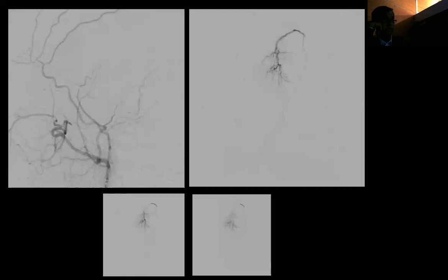All right. And this is the microcatheter. You can see probably the microcatheter is here, or maybe we advance it a little bit more, and start filling the tumor bed. So yes, we were able to advance the microcatheter as close as possible to the inside of the tumor bed, and we started to inject the liquid embolic material.